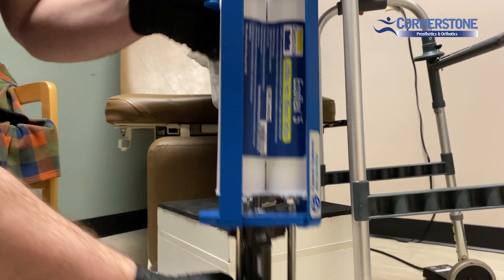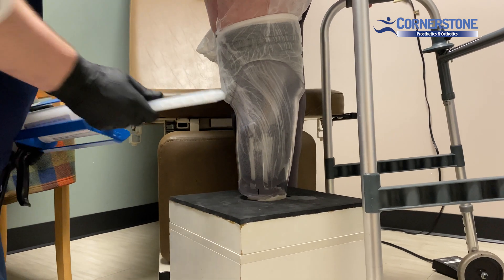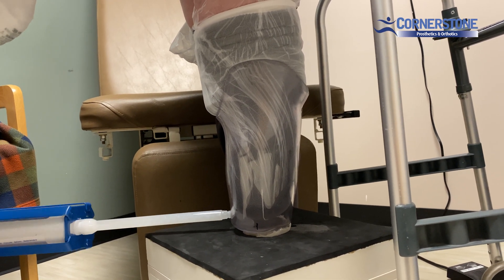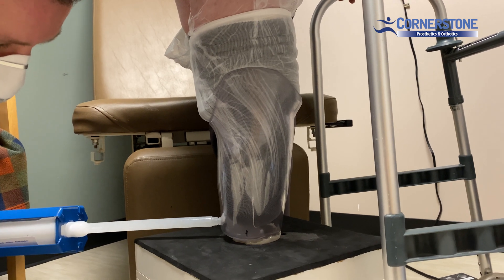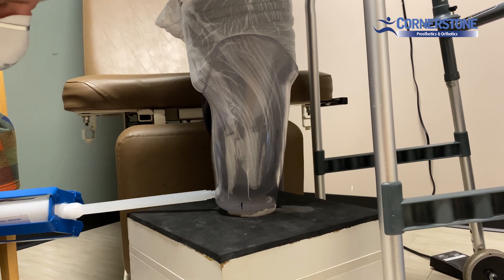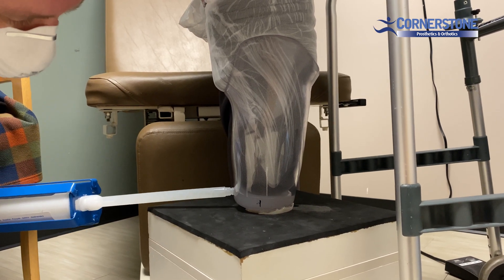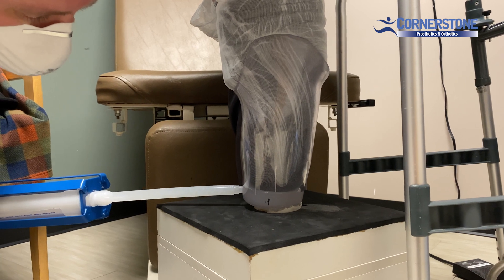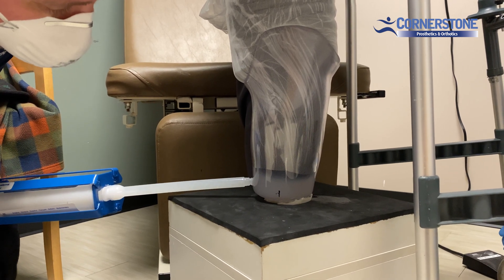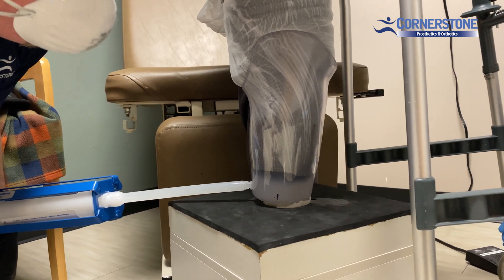Then we take our silicone, apply it to the port, and we start injecting. Watch for the silicone to fill in the space. Inject just enough that the limb starts to push up out of the socket, and once we see that, we'll stop. It looks good.